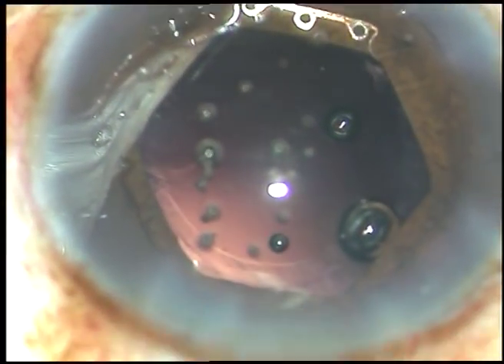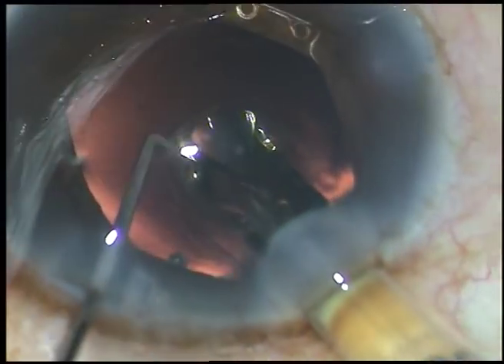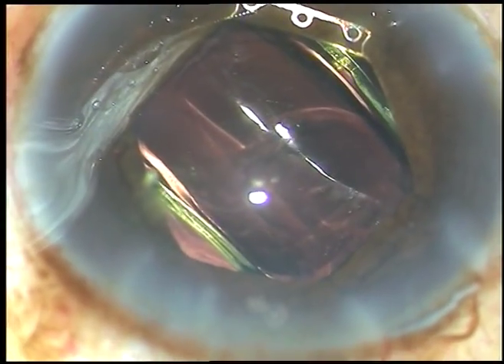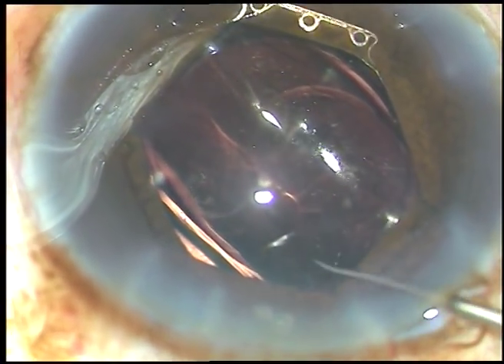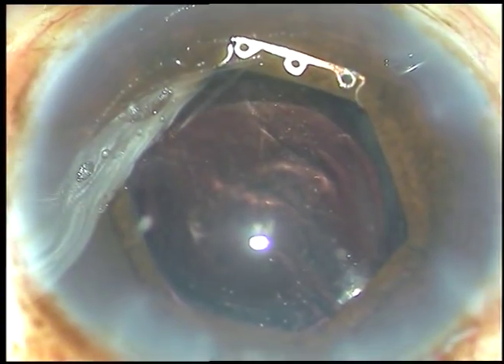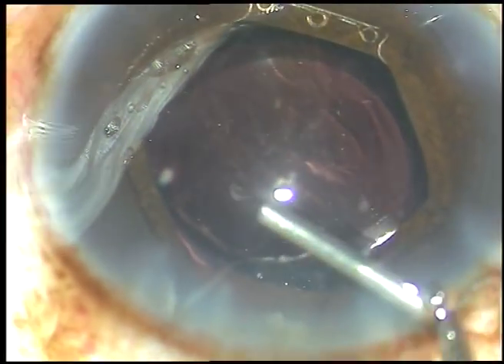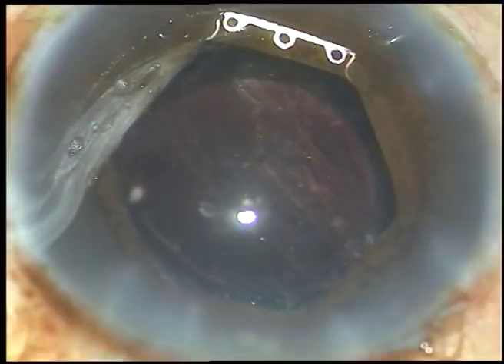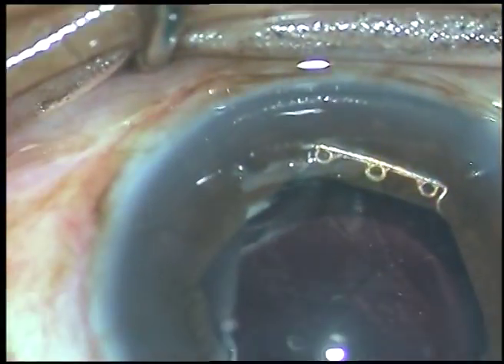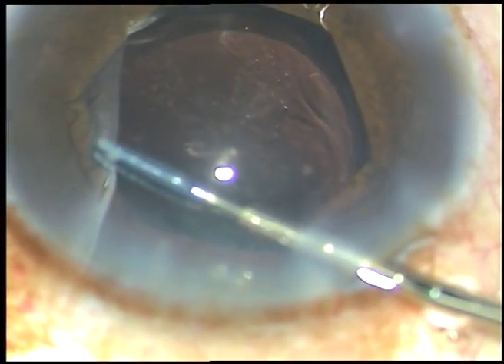Now I inject viscoelastic substance. In this case I am implanting a hydrophobic acrylic aspheric intraocular lens from Appasamy Associates. This is a beautiful lens — it opens not very slowly and there is no glistening in this lens. I have a follow-up of about three years with this lens. I have no financial interest but I have great respect for Appasamy Associates.